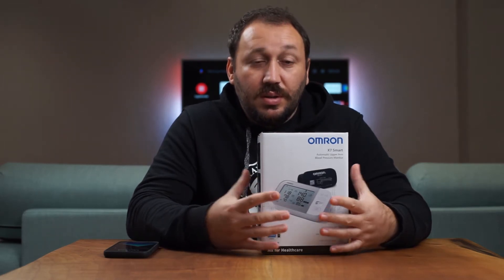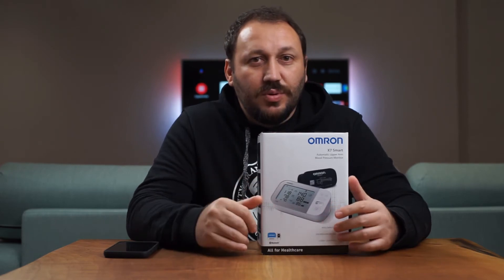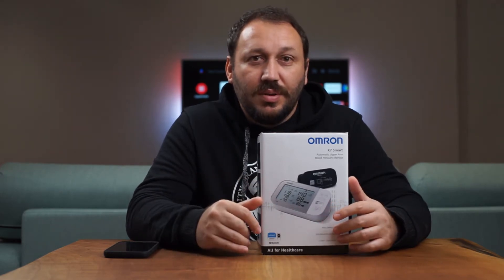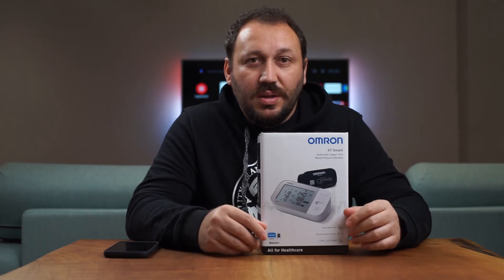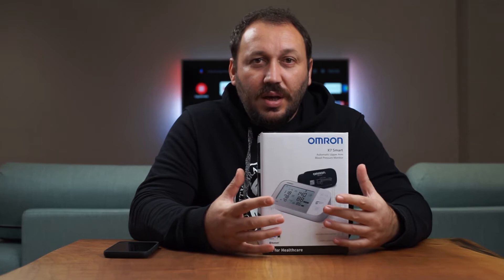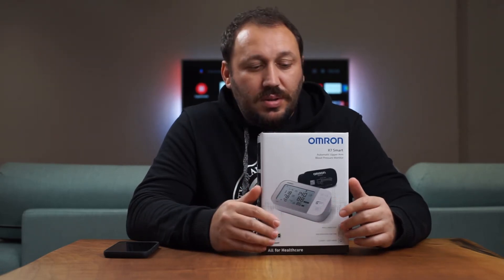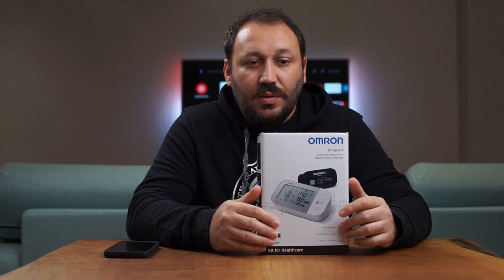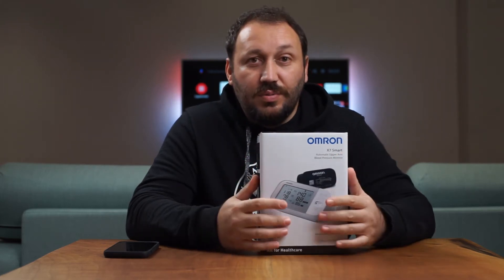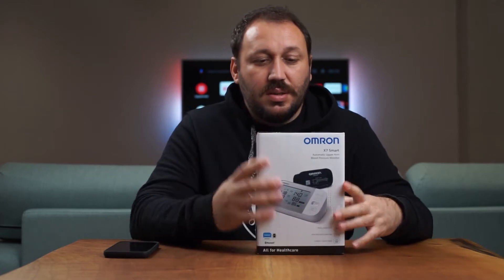That's a good thing — every time you measure, you don't need to remember anything. The readings instantly sync with your phone so you can keep all your records. That's really useful if you need to follow your blood pressure over time.